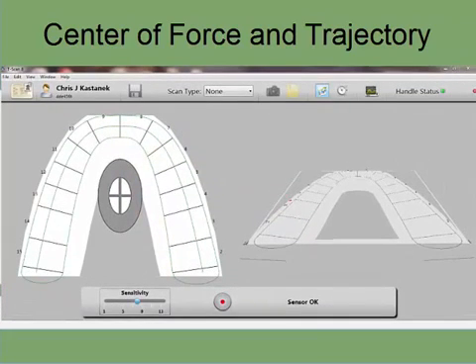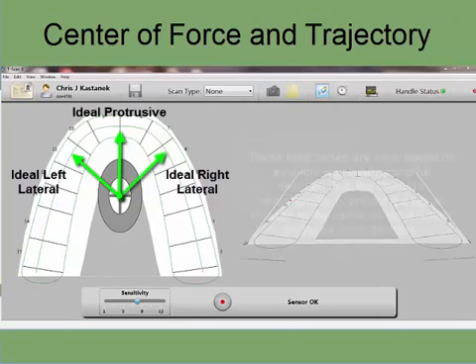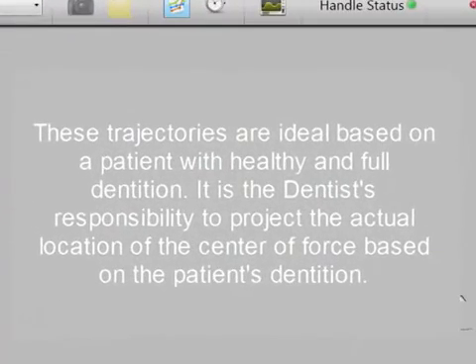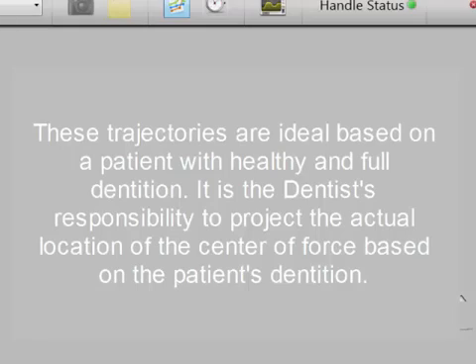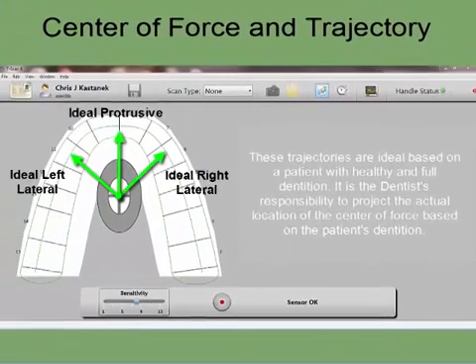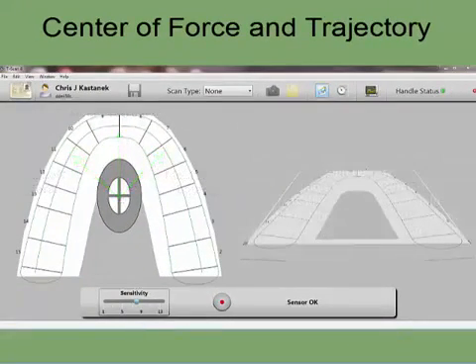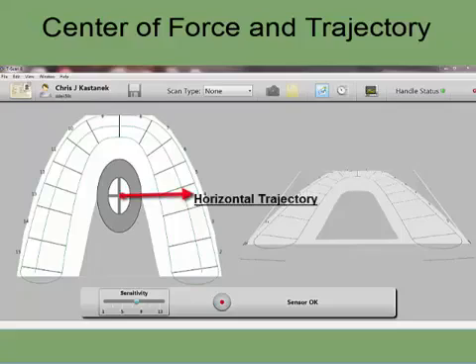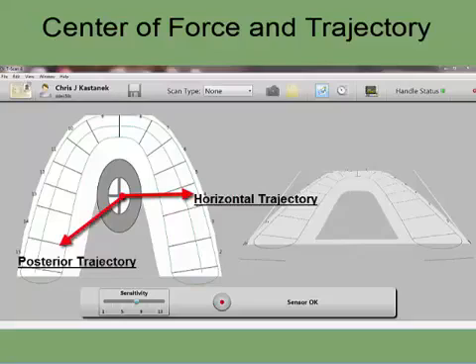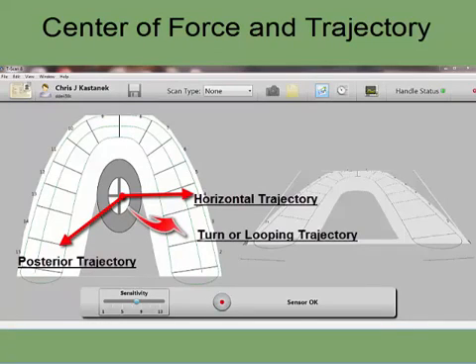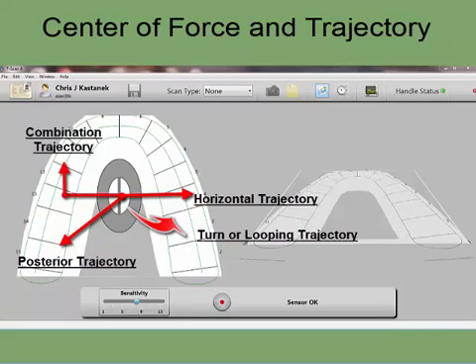Here is a visual of ideal trajectories for a left lateral, protrusive, and right lateral excursion. Common trajectories seen in patients include: a horizontal trajectory that may indicate group function, a backwards moving trajectory that shows a posterior interference, a turn or looping trajectory that can indicate balancing side interferences, and a combination trajectory that has two or more of the previous patterns.